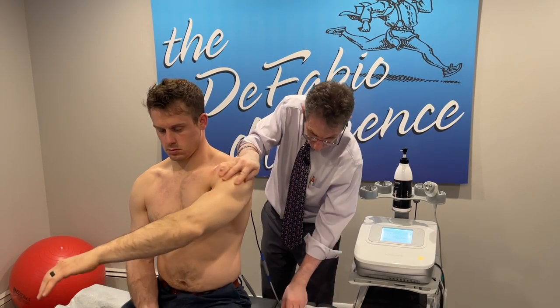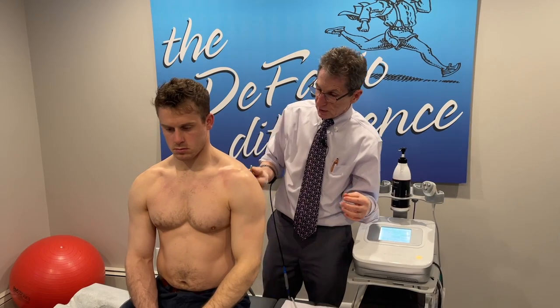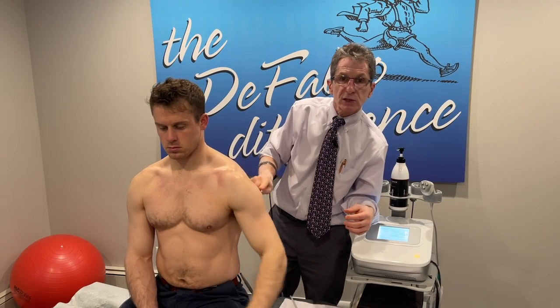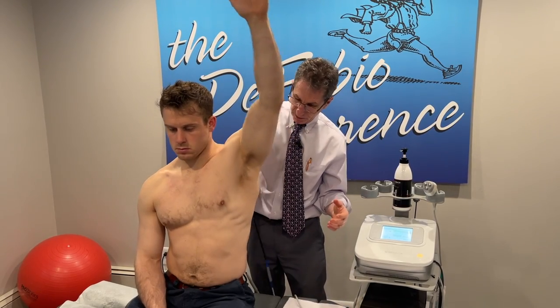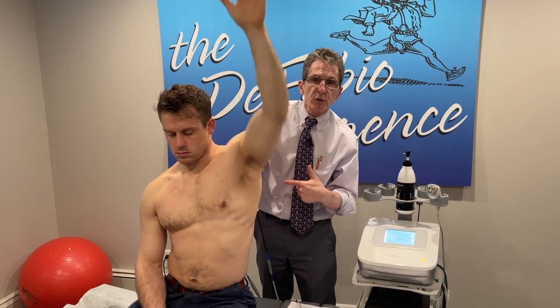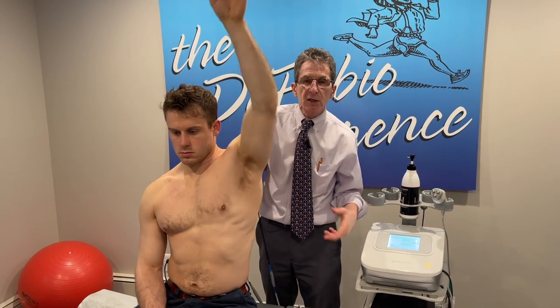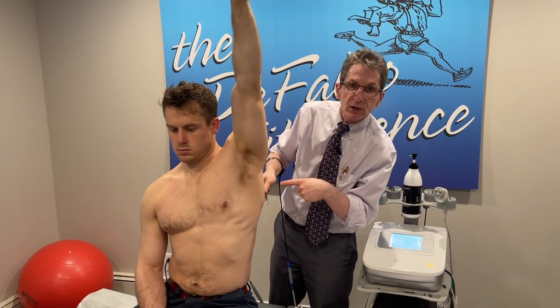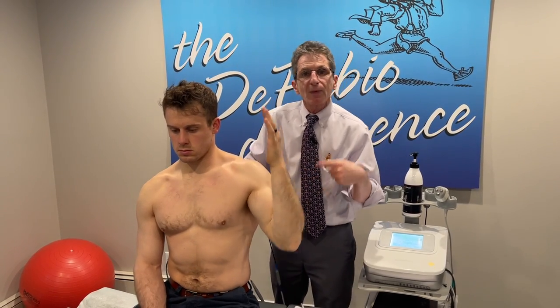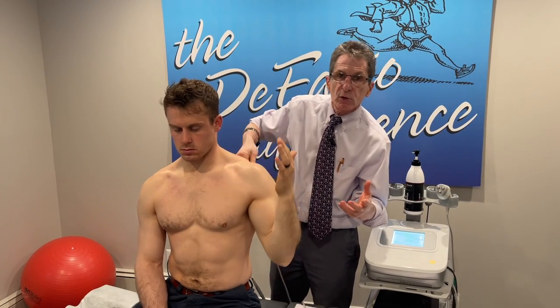We can also use a metallic tool — instrument-assisted soft tissue mobilization. Let's do abduction; reach for the ceiling. I want to do your lat. The therapy goes through the tool into my arm from the machine — deep therapy, stimulating circulation, breaking down adhesions and scar tissue with both the therapy and the instrument soft tissue mobilization.